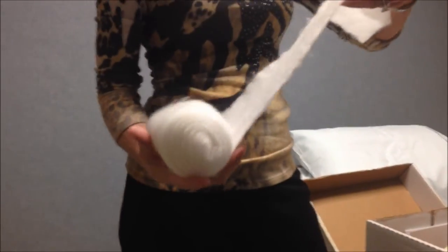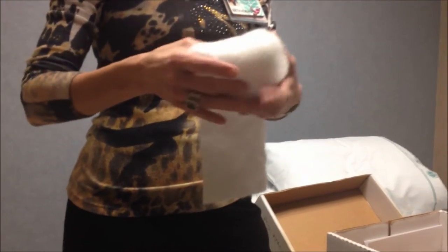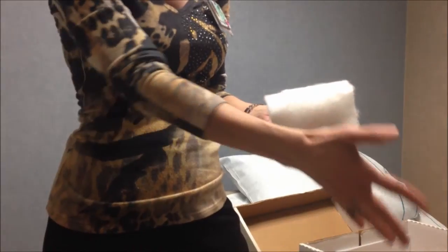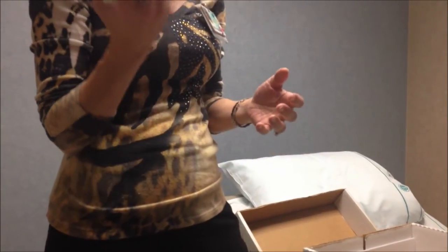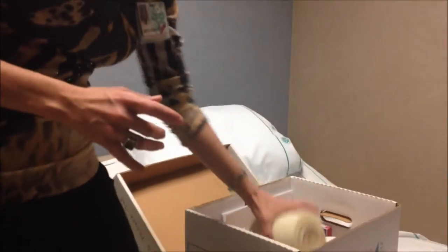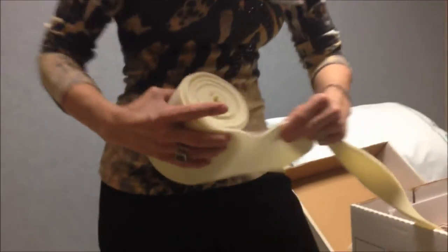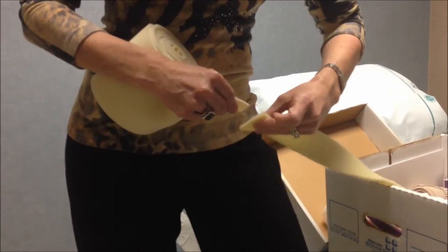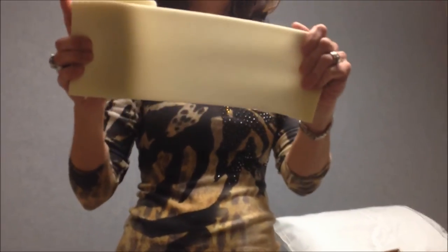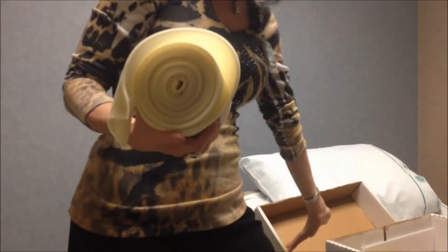With cotton, as you use it and use it, it starts to kind of wear and get narrow. You can't wash it, so that's kind of the downside to the cotton. Rarely do I ever use this on a leg unless the swelling is very mild and you're maybe only wrapping to the knee. I would never put this on the thigh because everything slides right down. I tend to personally prefer foam — foam sticks too. The old timey foam that used to exist was about twice the size of the normal foam now. The nice thing about foam is it actually has stretch to it so you can conform better, and it can be washed in the washing machine and air dried, which you can't do with cotton.